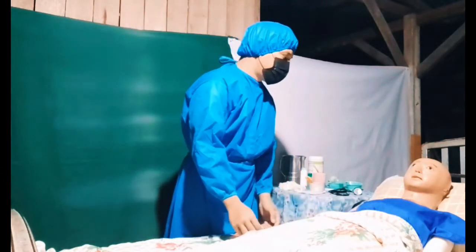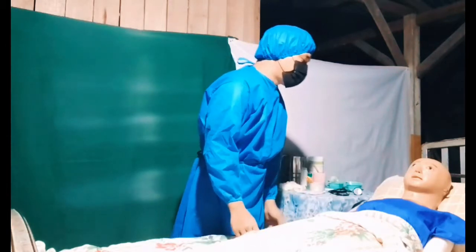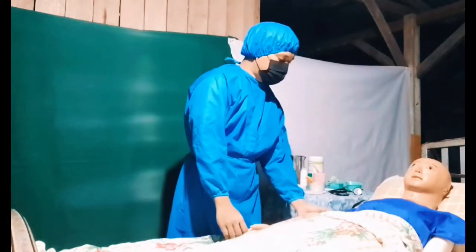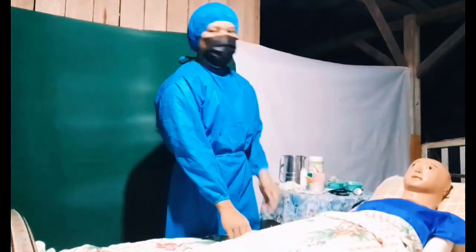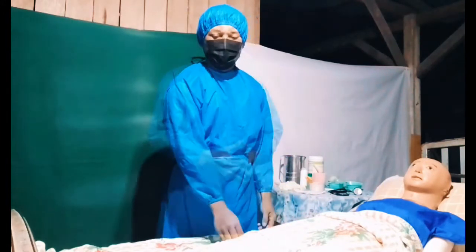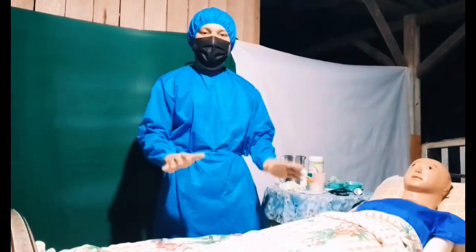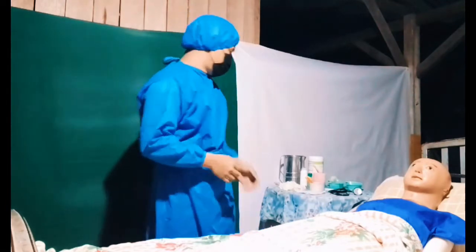And ma'am, today we're doing a nasogastric therapy. So, I'm going to insert the NGT tube in your nose. Is it okay? Before that, do you want to micturate or defecate? And if not, you must prepare the equipment. Prepare equipment. After preparing equipment, do the hand washing.